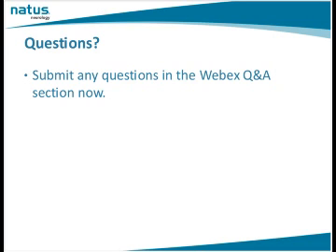All right, thanks, Katie. When you turn on the light and it raises the velocity of the PCA, does it take away velocities from other vessels? That's a good question, and it's an interesting question. The answer is no. It doesn't steal any flow from other vessels.